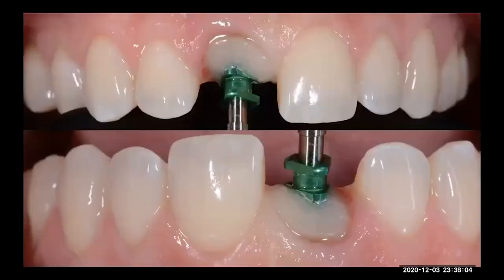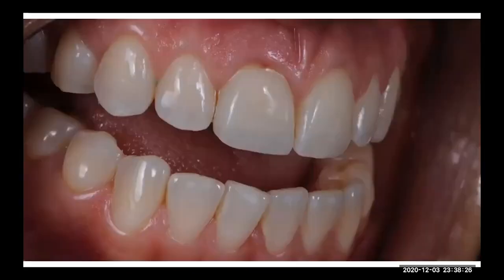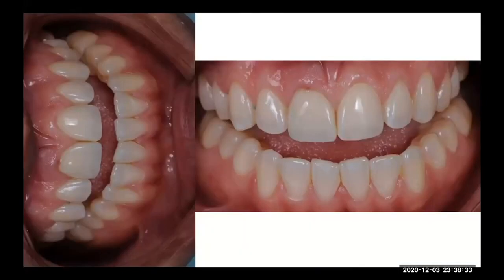This is another central. He did all his job, a really nice job, and gave me the information of his soft tissue. We did a try-in, the same problem. Everything was a little bit light, because I think the technique of taking the color is really, really sensitive. Then we modified the tooth, and this is the day of the delivery. We can see the integration of our single crown in the mouth. You can see different angles, all the incisal movement, all the incisal colors are there.